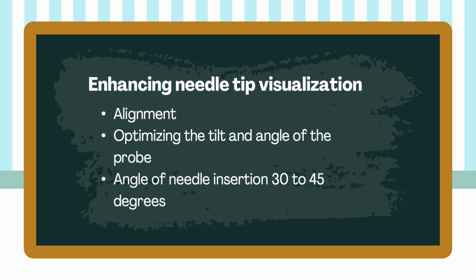Things that can actually be done are ensuring that the needle and the ultrasound are properly aligned, optimizing the tilt and the angle of the probe to ensure a perpendicular angle, and the angle of insertion of the needle should be 30 to 45 degrees.